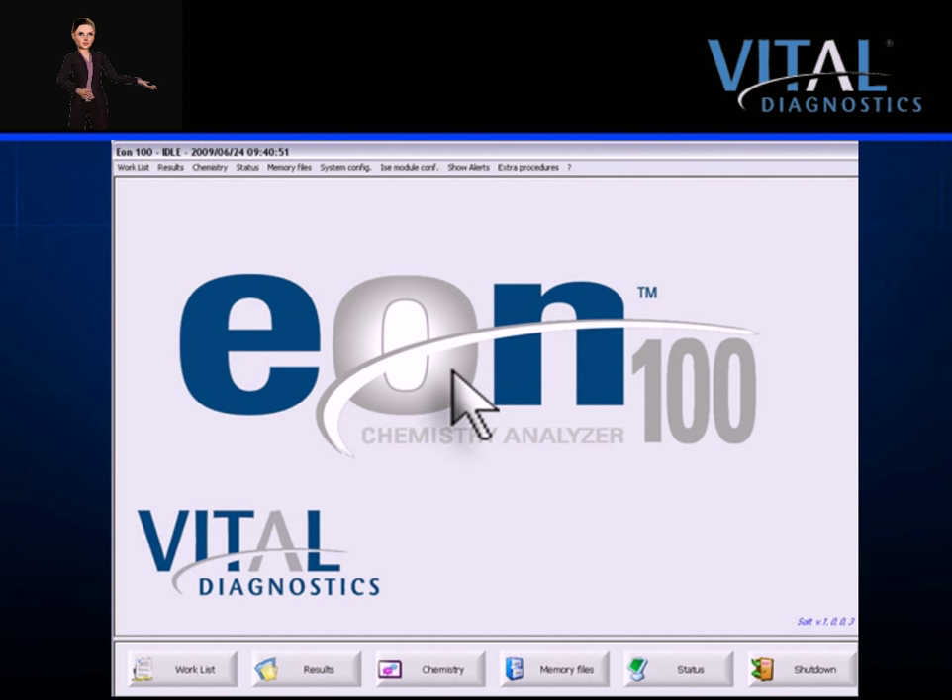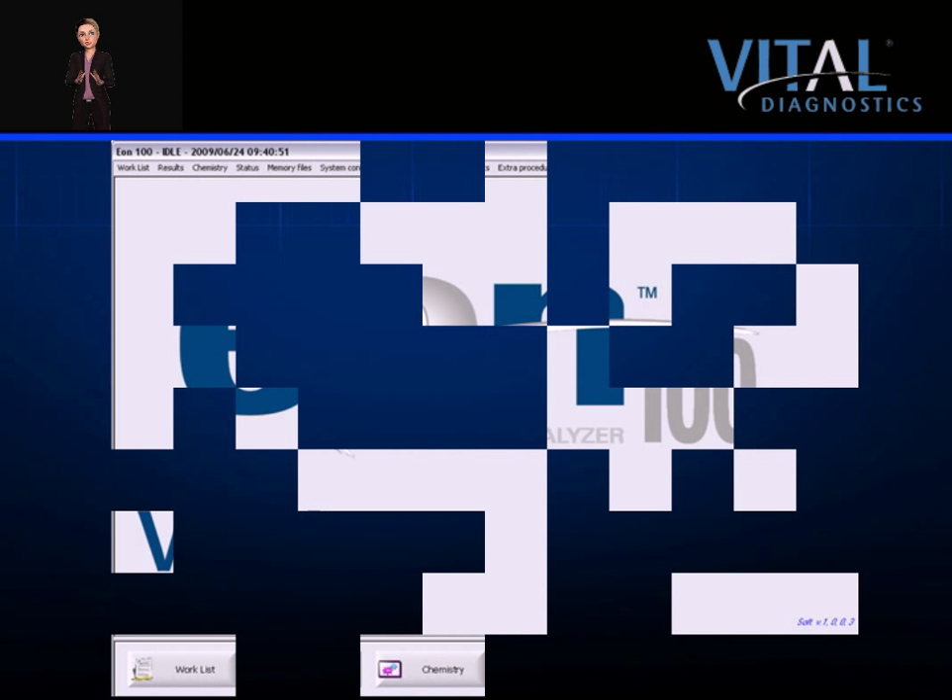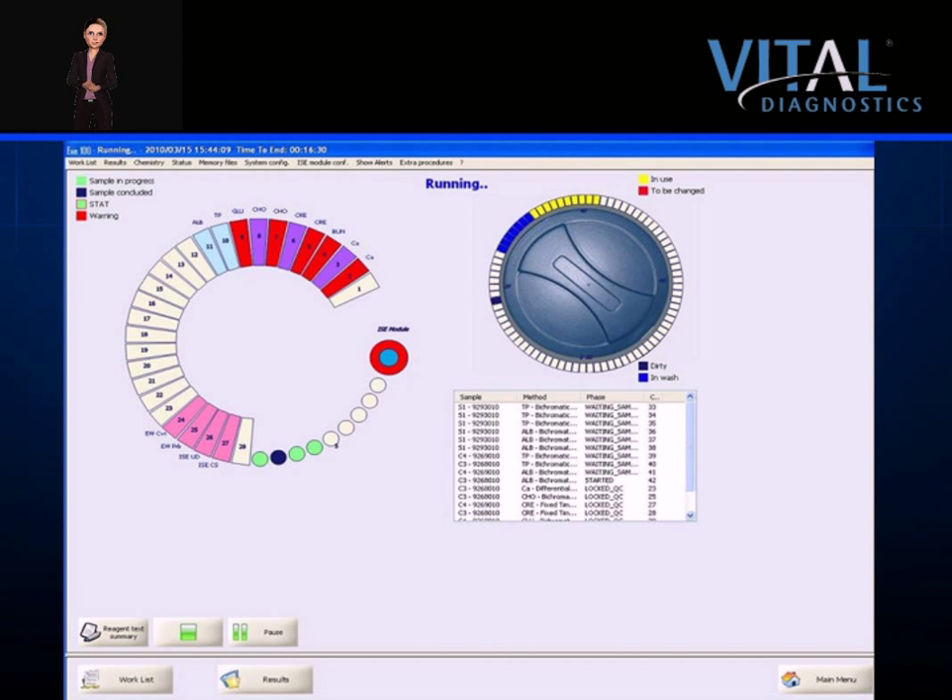The status screen, which serves as the primary screen, is packed with useful real-time information that can be seen from across the lab. Along with audible alerts, this allows for longer walk-away time. The instrument status — idle or running — is displayed, and the status of each sample is shown with a color-coded symbol to indicate in process or concluded. The ISE status indicator is also displayed. Reagents are color-coded, and you may click on any reagent position for detailed information. Red usually indicates a problem and may be researched by clicking on the error message. The status of the cuvettes is shown, with the instrument visually indicating which cuvettes are dirty, in use, or in wash. Test status, position number, sample ID, method, phase, and cuvette number are also indicated.